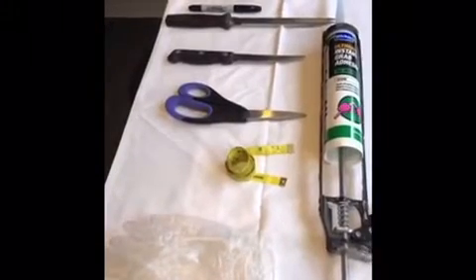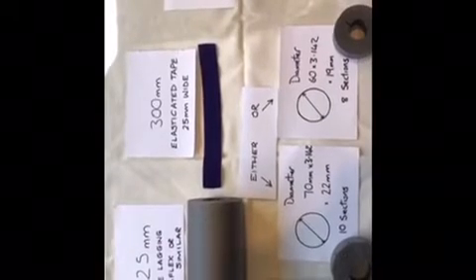How to make a full face visor. This is the equipment needed to make the visor. Materials required to make the mask.